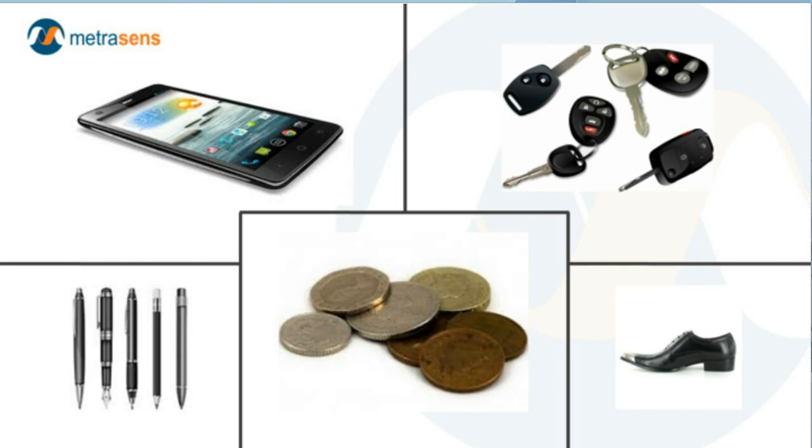Each has a story of its own, of course, but crucially, I believe that it's often by the radiographer's quick thinking and a great deal of good fortune that no one appears yet in the UK to have lost their life to the missile effect. Only 10% of reports globally are estimated to be from the projectile effect. Now, this isn't to say that the projectile effect doesn't happen more often, as indicated in the survey, it just doesn't get reported so much, likely only when someone has been injured or the equipment has been damaged.